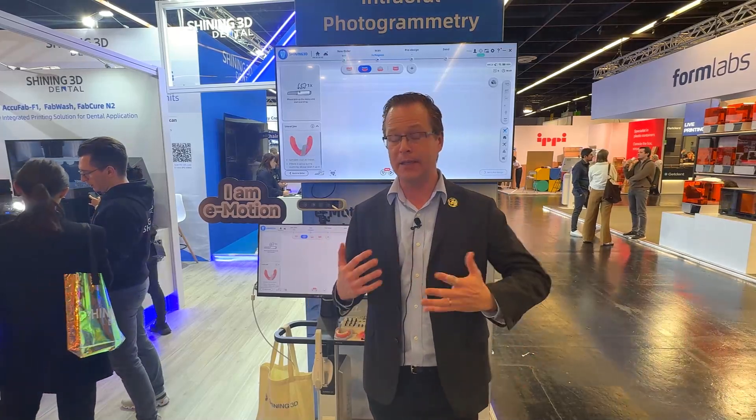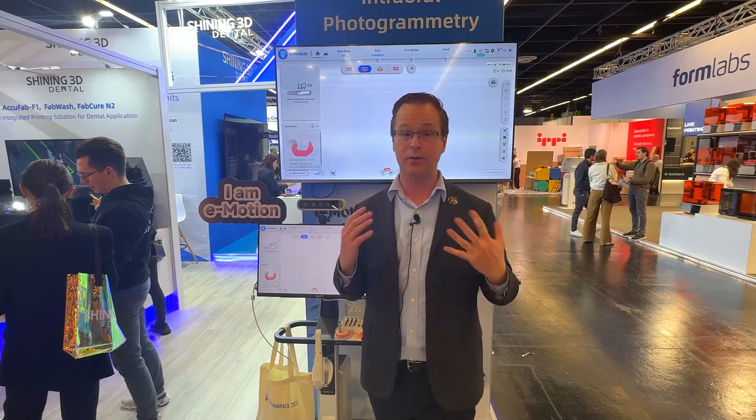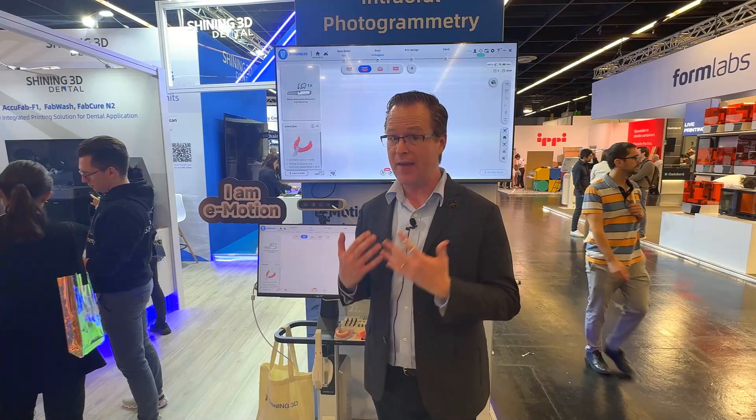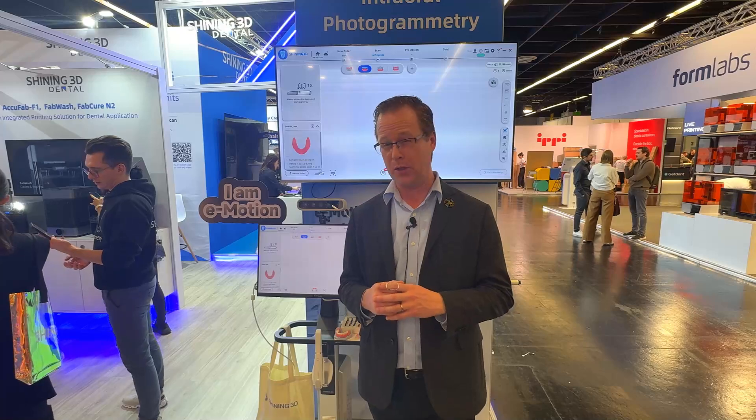I've got a lot of my friends coming to me telling me about what's happening over at Shining 3D, especially with their Elite Series scanners. I came on over to the booth to take a look, and they've got a couple of new releases here at the show that look really pretty cool.